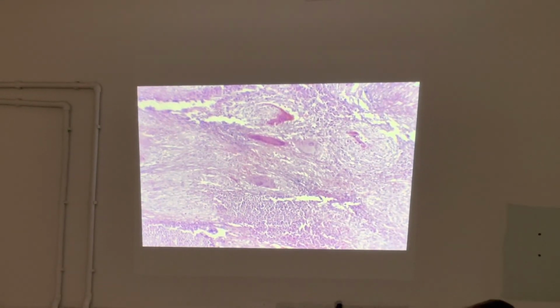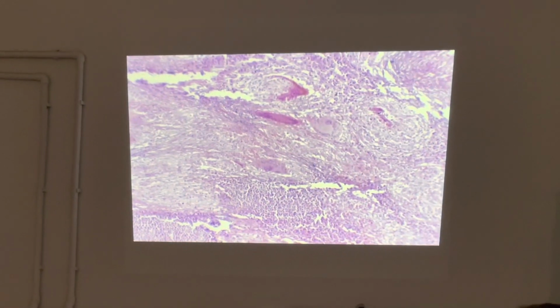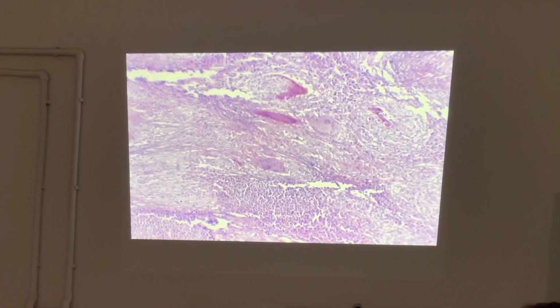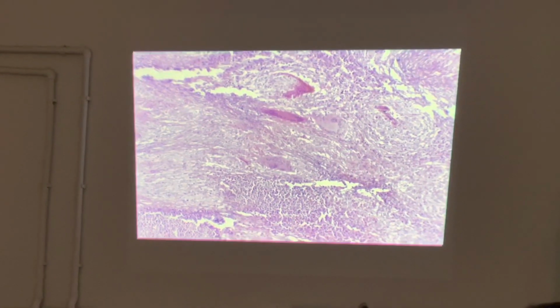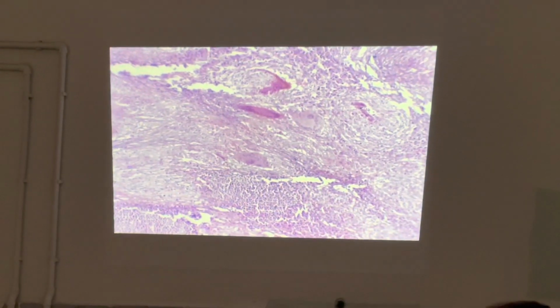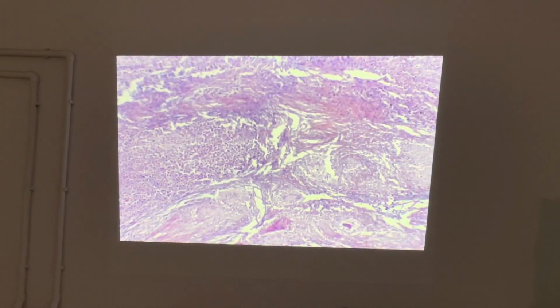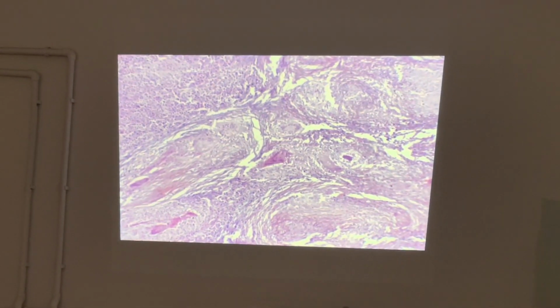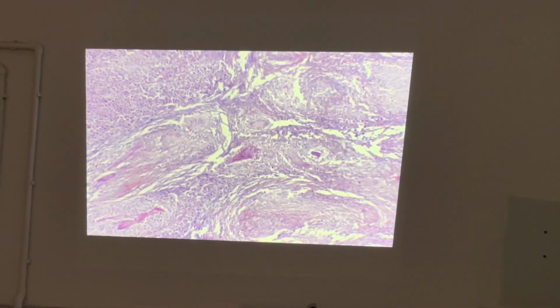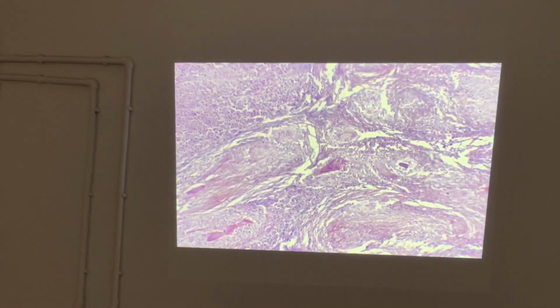Nisa, what about the last diagnosis? The granuloma is what? It is a typical type of chronic inflammation. So we have a chronic inflammation of the lymph node. Chronic lymphadenitis, but which type? Granulomatous lymphadenitis. Why? Because we have a granuloma throughout the section. Take a look. All the lymph nodes. Actually, here we have a large number of giant cells. All of them is what? The giant cell. So the diagnosis will be granulomatous lymphadenitis.